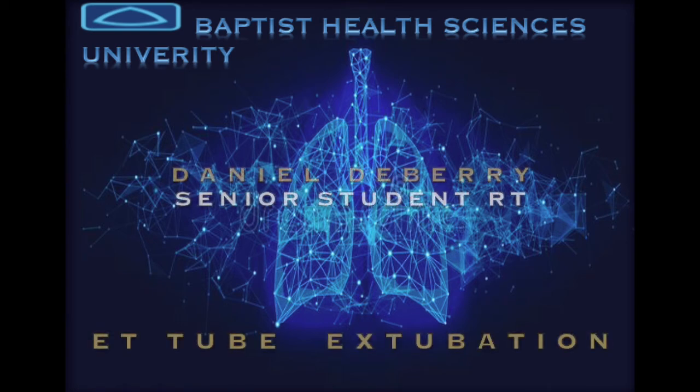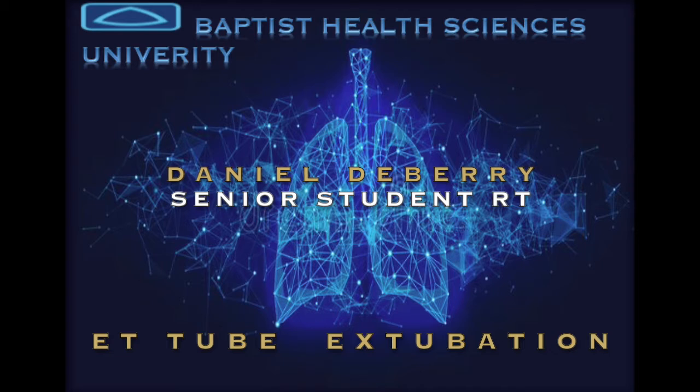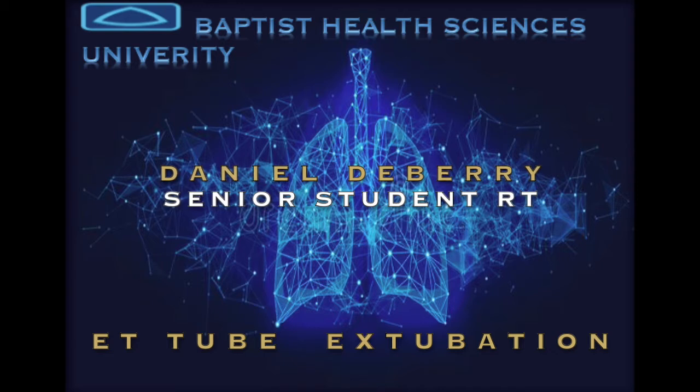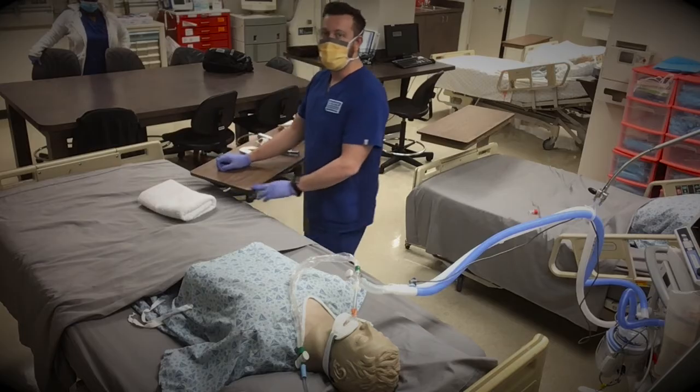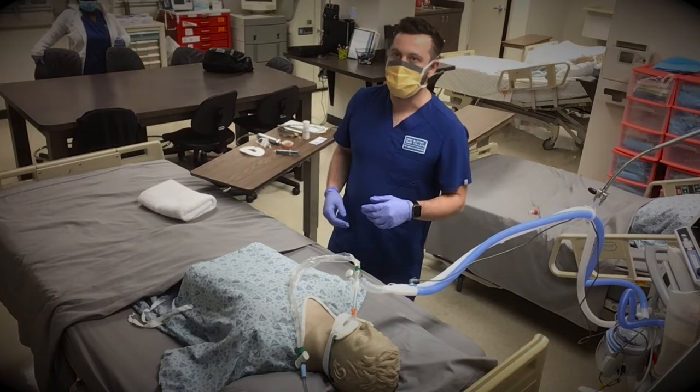My name is Daniel DeBerry. I'm a student respiratory therapist here at Baptist Health Sciences University. And today what I'm going to be sharing is how to perform a successful extubation on a patient who is intubated. So first, the environment.